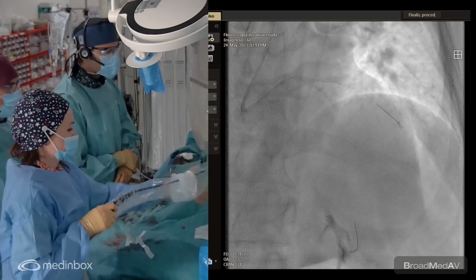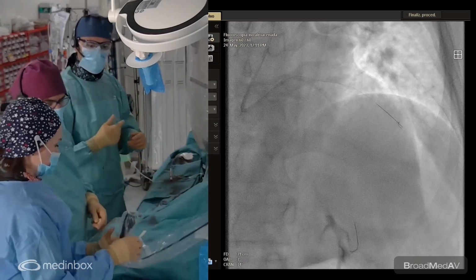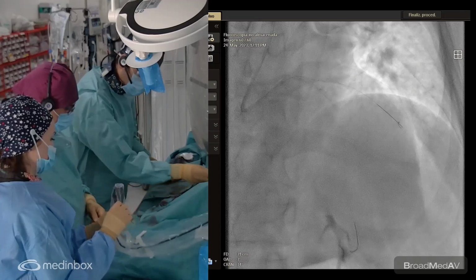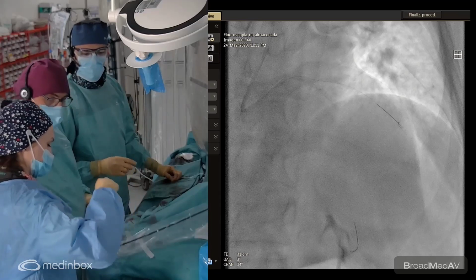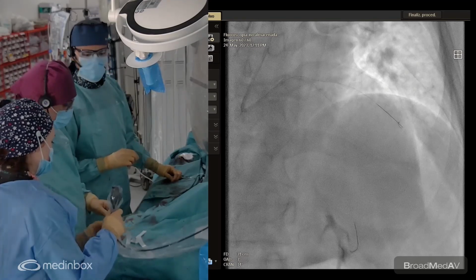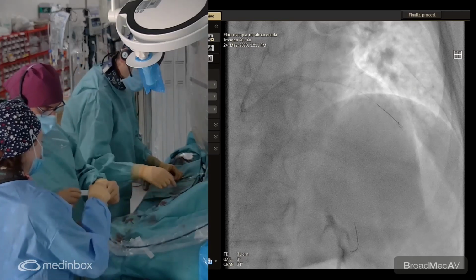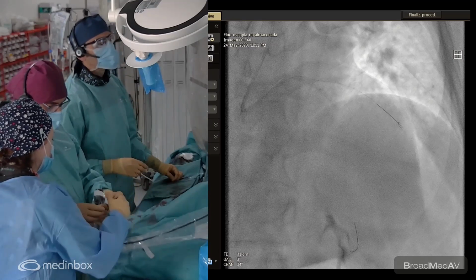This plastic cover of the shockwave is one important thing. It seems easy, but it is not so easy. And the next generation, the C2 Plus balloon, apart from the most important advance that it has 120 pulses, not only 80 like this one, has a specific plastic cover for the connection.